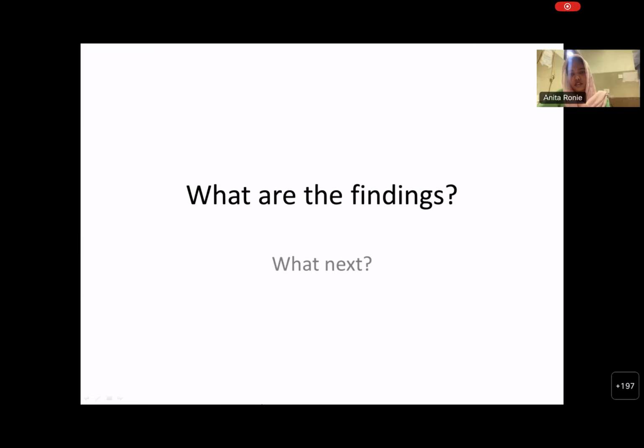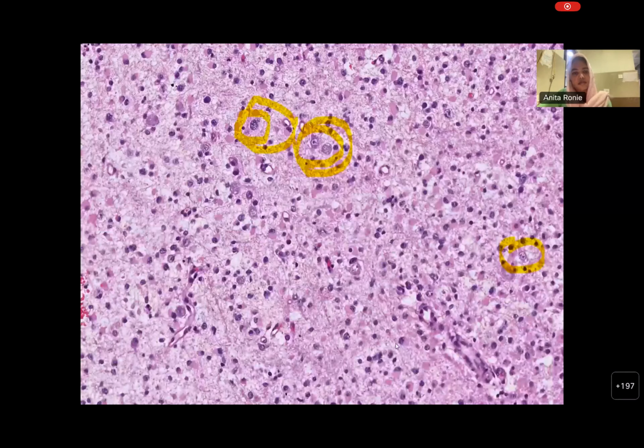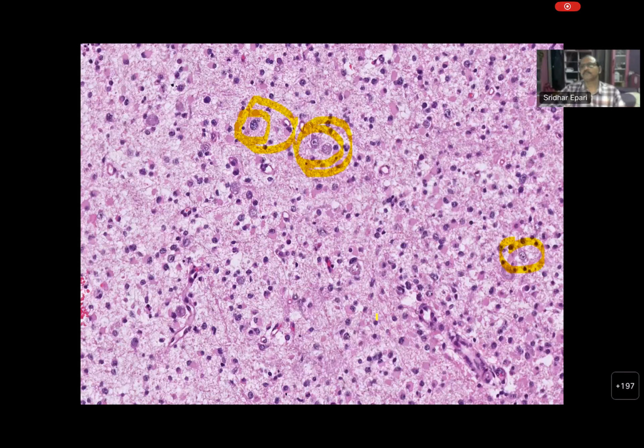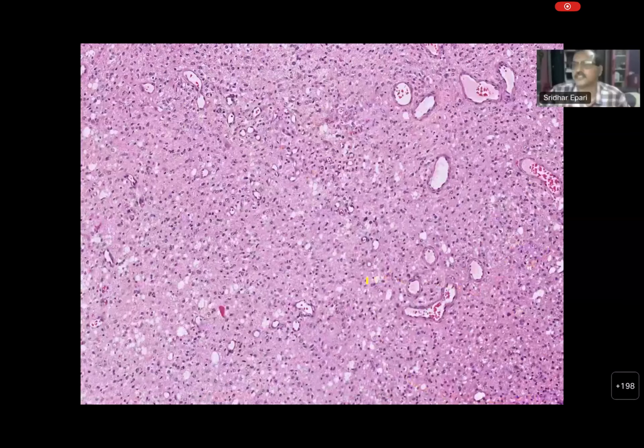Is this microvascular endothelial proliferation? So you have to see endothelial proliferation. What does it mean, endothelial proliferation? How do I interpret? You'll have a morphology like a glomeruloid. So if you don't have a glomeruloid, you should not call it, right? We are seeing only a single layer of endothelial cells, sir. Yeah, so you should be careful about over-calling. This probably amounts to increased angiogenesis, but it is not microvascular proliferation.